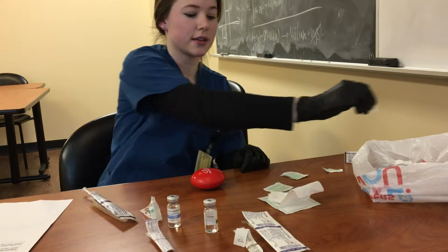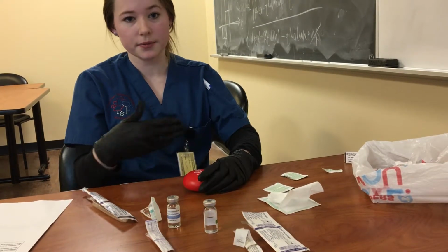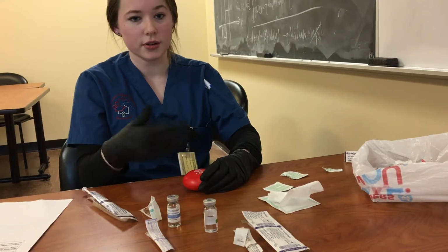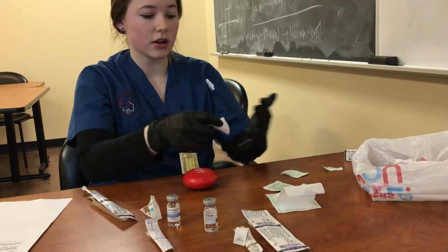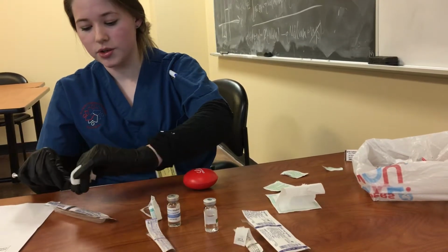And I can discard of the gauze, of the alcohol wipe. I'll let that dry briefly. I don't want it to sting when I do it. And because we are giving heparin, this will be at a 90-degree angle. I want to have my gauze in my non-dominant hand, ready. And I can take the cap off of the syringe.